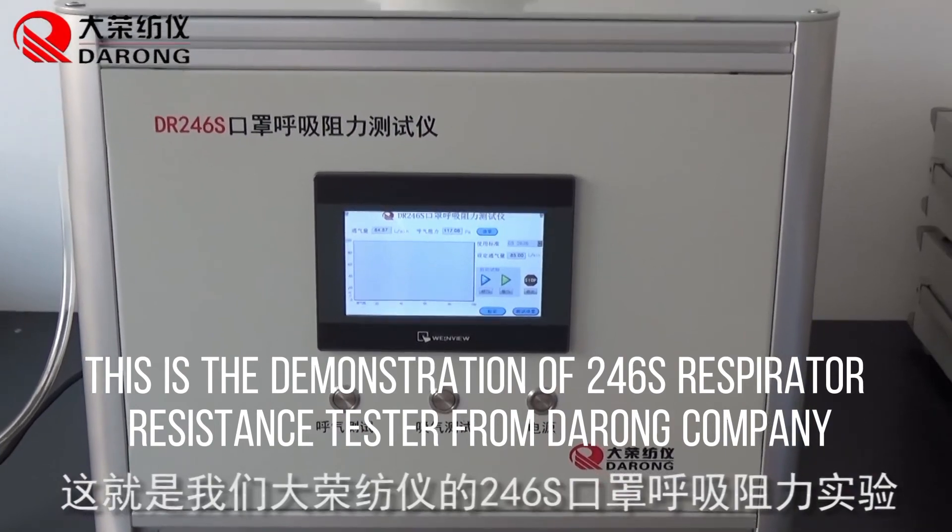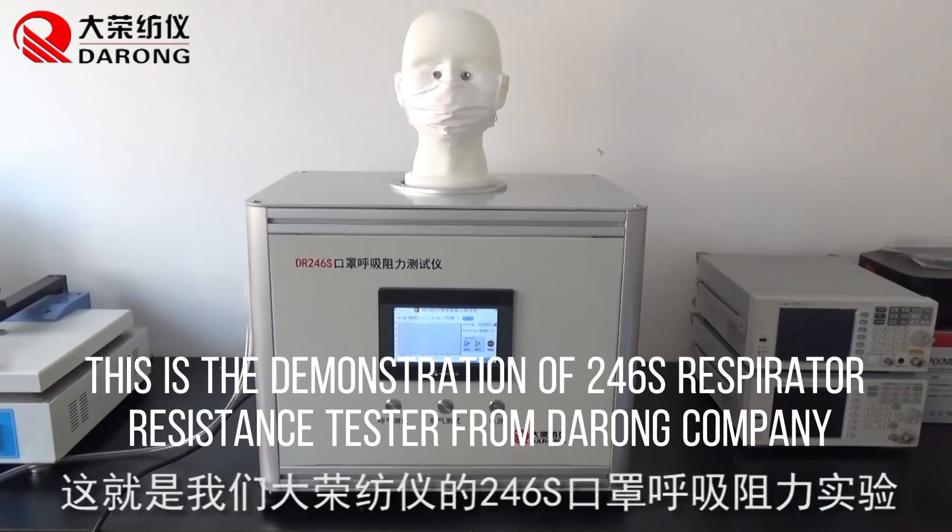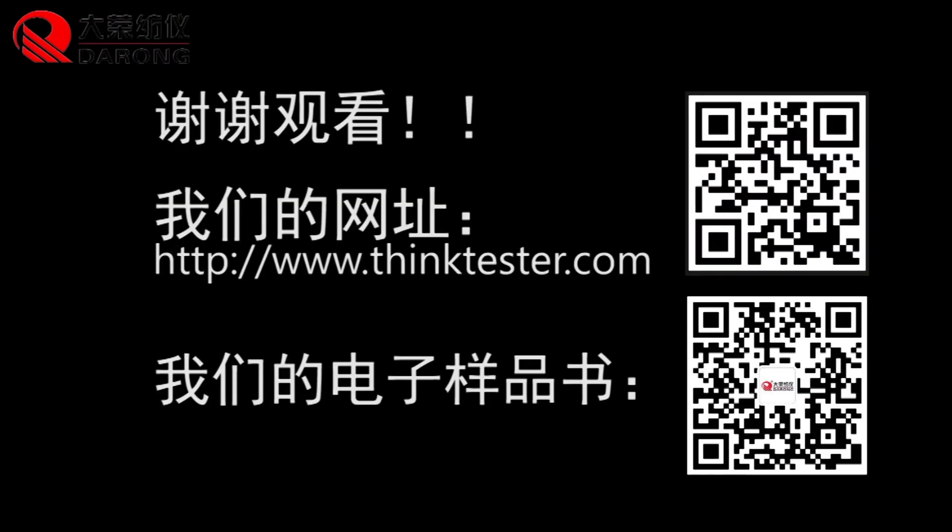This is the demonstration of the 246S respirator resistance tester from Darong Company.